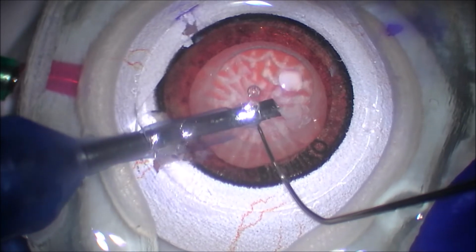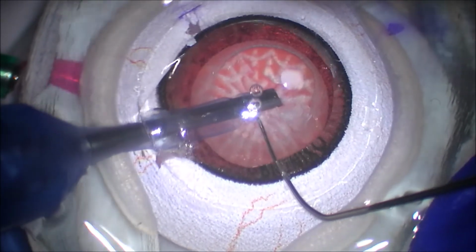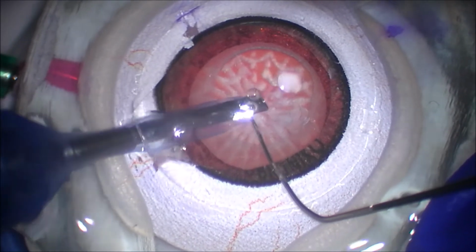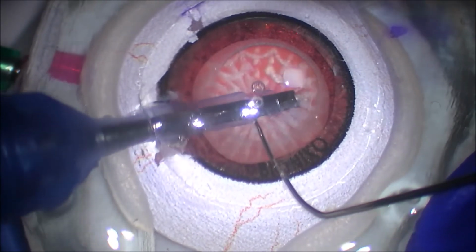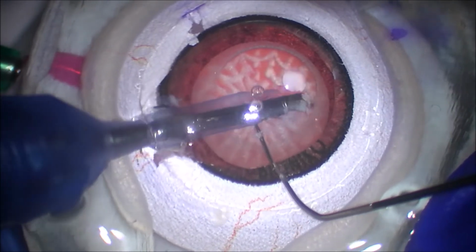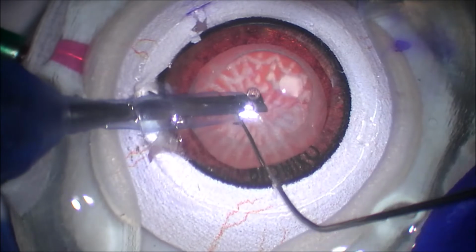And so she's doing the best she can to grab these small pieces, but as you can tell, she's having a little bit of trouble here. She's using some vacuum to try to grab some of those pieces out in the periphery. And of course, I'm explaining to her the balance between using aspiration and vacuum versus using ultrasonic energy.